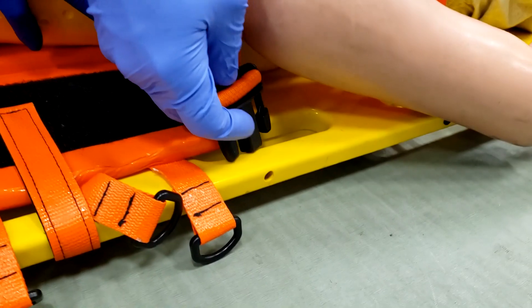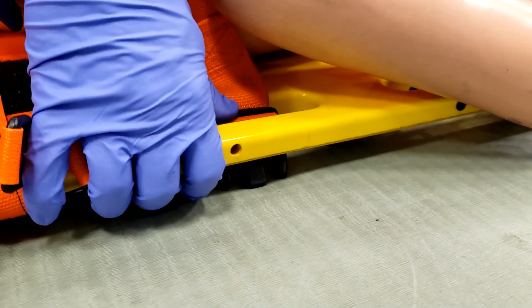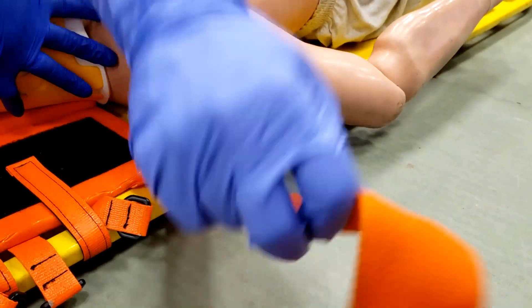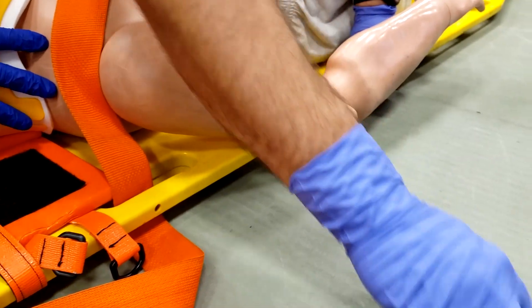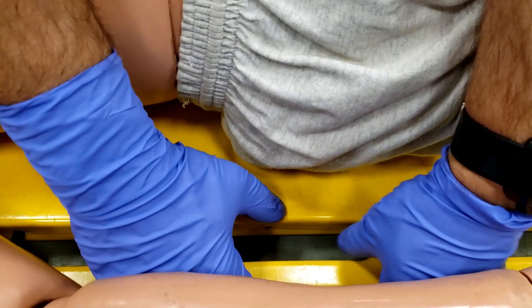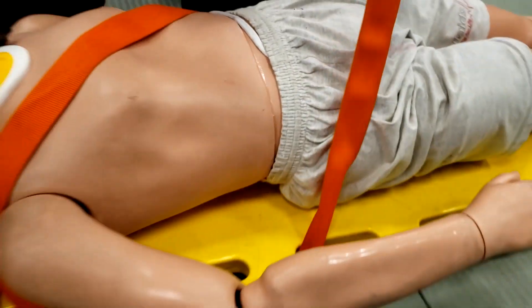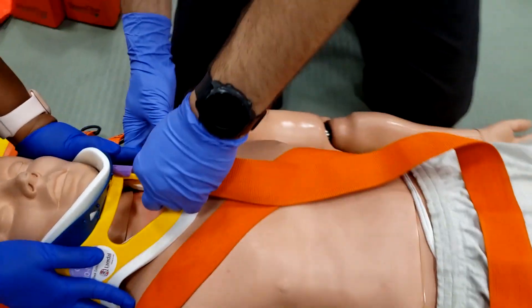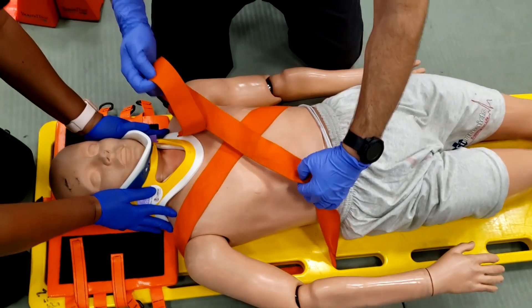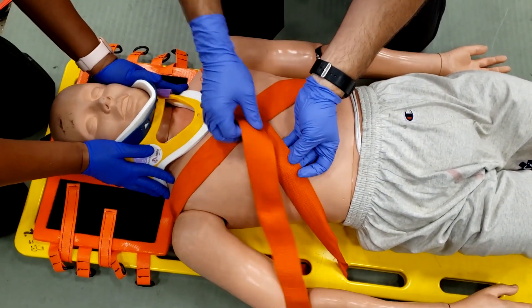Feed the male buckle down through the board and continue downwards to match the same pattern on the other side. Secure the two buckles back together, paying close attention that they remain on the upper right or left side of the patient's chest and never along the middle, in case CPR needs to be done. Also, pay attention to the straps so they lie flat against the patient's skin.